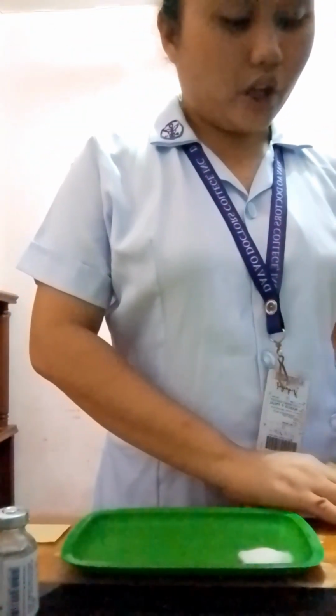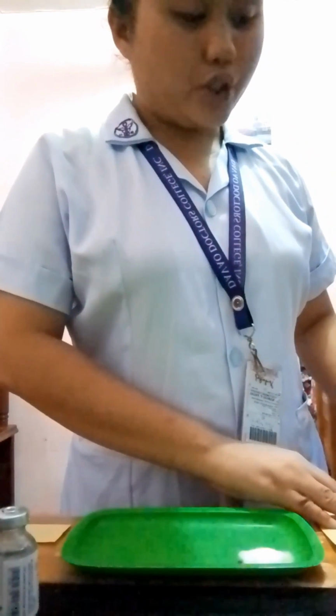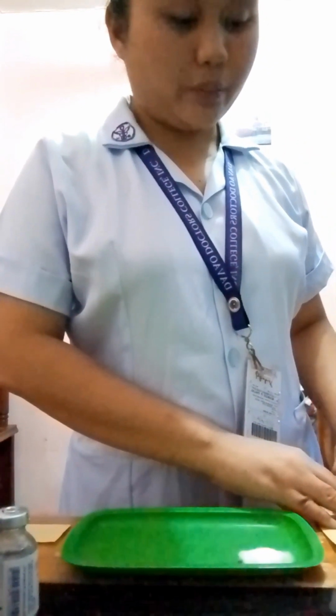So before we could actually draw the medication into this vial, we first need to do the mathematical calculation of the exact dosage needed. So the doctor ordered 5 mg of morphine sulfate. It should be divided by the stock on hand, which is 5 milligram per ml. Okay, so the desired dosage divided by the stock on hand and multiplied by the quantity.